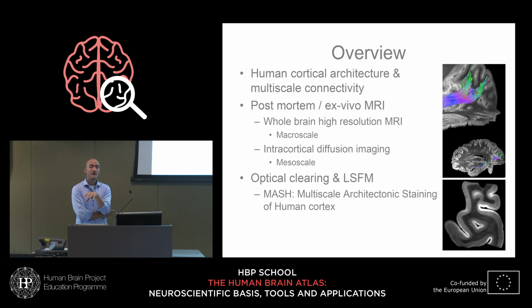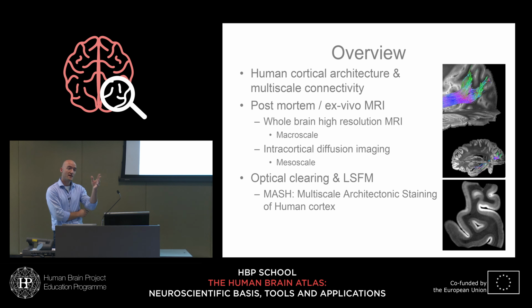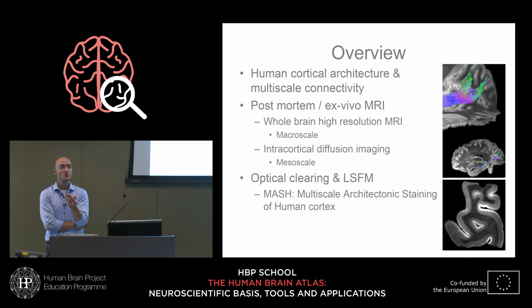And the perspective that we have in our lab is to do it ex vivo with MRI at much higher resolution than you could achieve in vivo, and I'll show you a lot of images about that. But at least it happens with the machines, the 7T and the 9.4, that can also be applied in vivo, so even though it will be maybe an order of magnitude less resolution, we learn a lot about what we could potentially see in vivo. Simultaneously, in those ex vivo samples, human brain samples that we use, we try to make them the whole human brain, or large parts of the human brain, not just tiny sections. And to also map those with light microscopy techniques that are capable of covering, in principle, those entire large pieces of human brain, so that we can cross-correlate between MRI and light sheet microscopy.